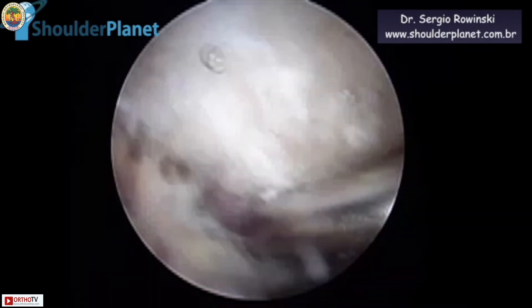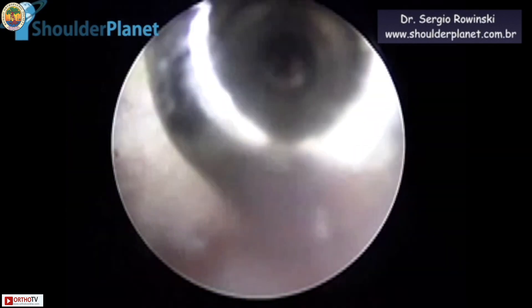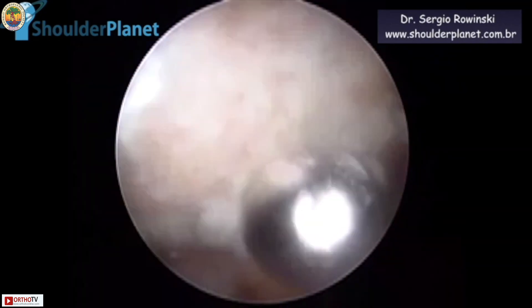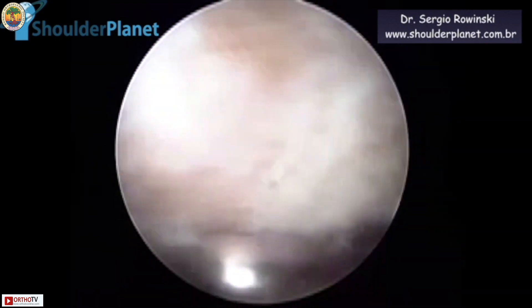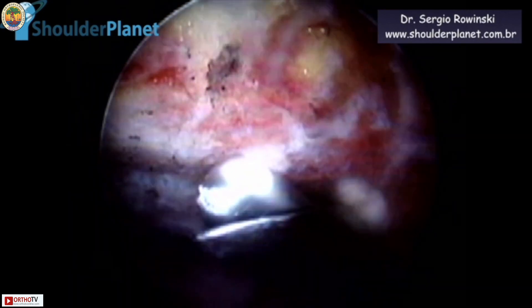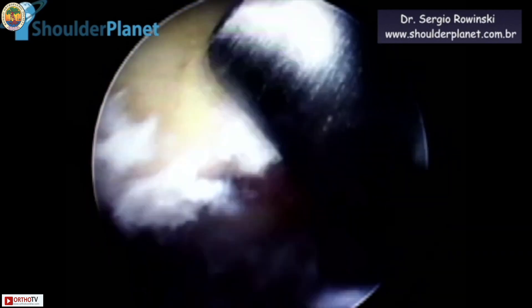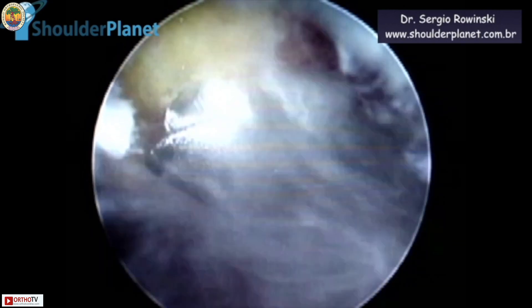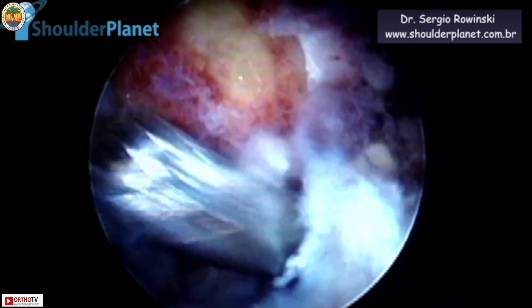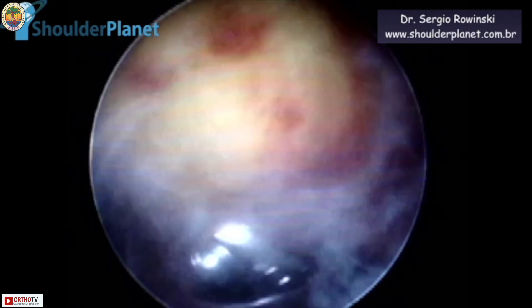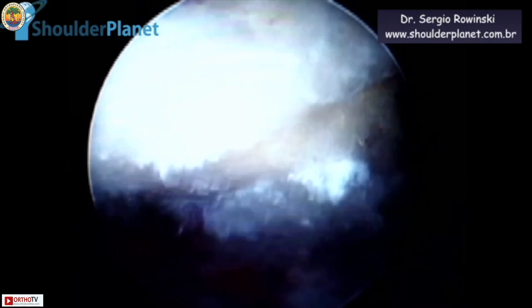At that moment I always like to change the portal. Now we are working through the anterior portal and watching through the lateral portal — a very nice way to confirm that the coracoacromial ligament was very securely detached from its acromial insertion. After that, we started to perform the acromioplasty. Sometimes I do it entering through the posterior portal and sometimes through the anterior one. We are working on the very distal part of the acromion, going from medial to lateral. The acromioplasty was quite finished — a type II acromion was turned into a very flat one. Now we are coming from posterior to anterior, confirming that a formal decompression was performed.